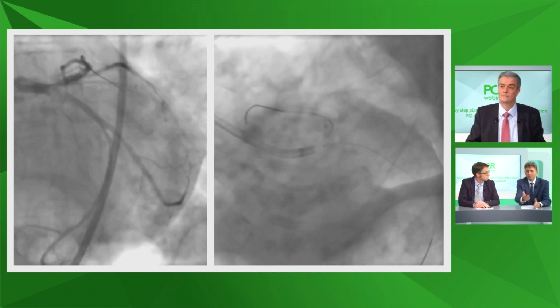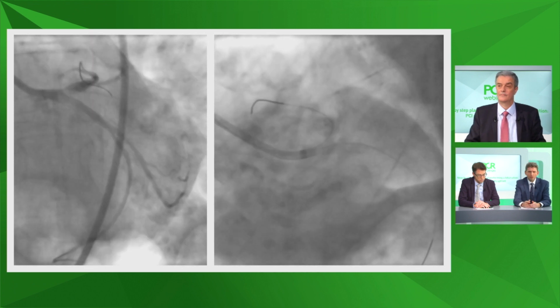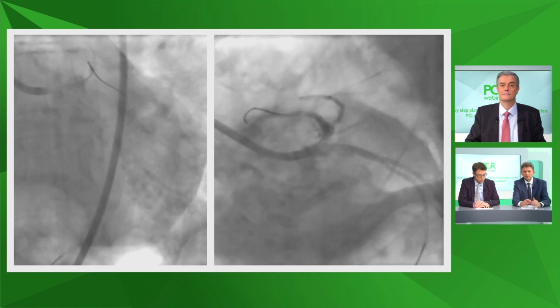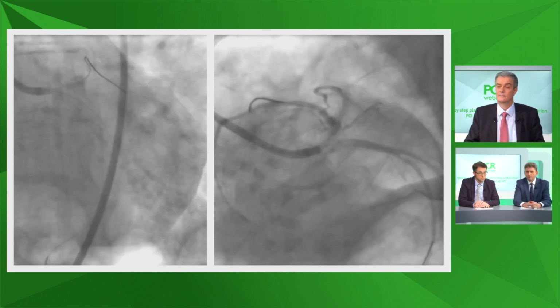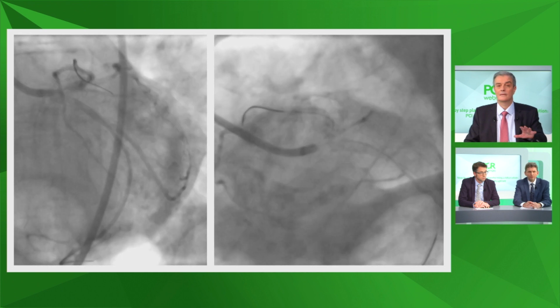So, of course, it is doable with a 6 French catheter radial approach, but given the size of the vessels, left main and large, almost dominant circ, we may expect that the larger burr will be needed. So I can only congratulate that you upfront chose the big guiding catheter, but it's really important in this case.